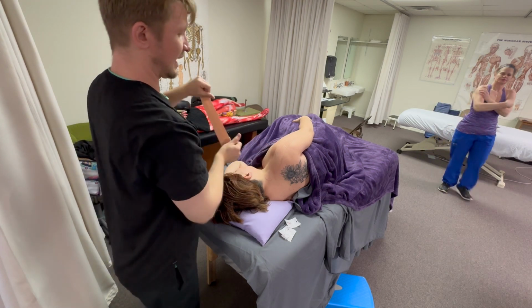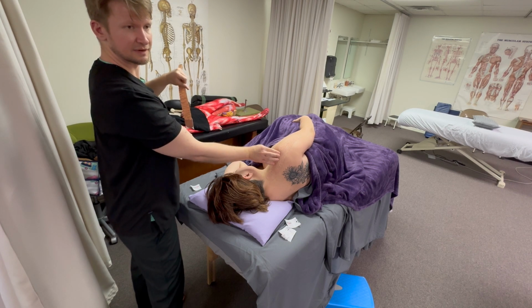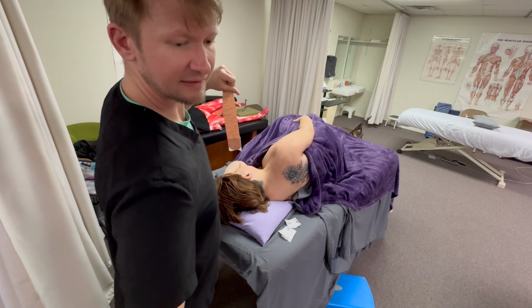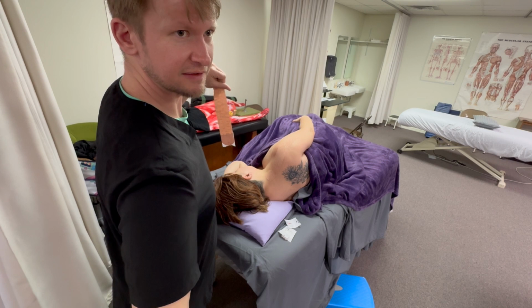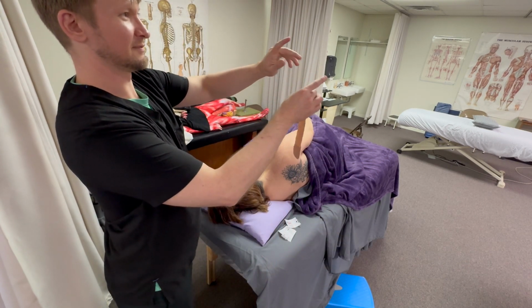Find the AC joint. I can kind of see it. So it's further out than you realize. I'm trying to find that acromioclavicular joint. That's this right here, where the clavicle meets the scapula. When you feel in your own body, try to be very careful.